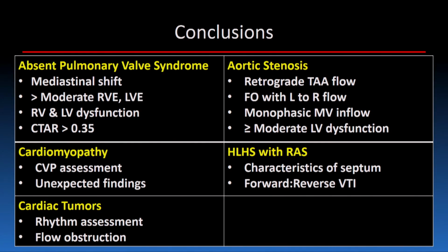So here's my summary slide that basically summarizes the 5 lesions that I decided to pick of lesions that may progress in utero and those important echocardiographic factors that we assess throughout gestation.